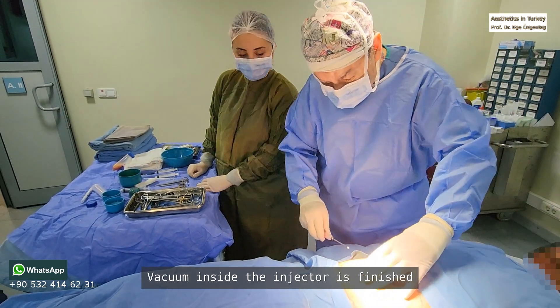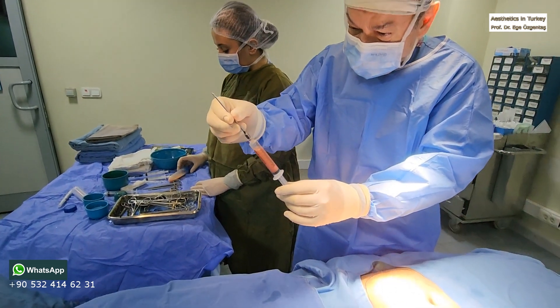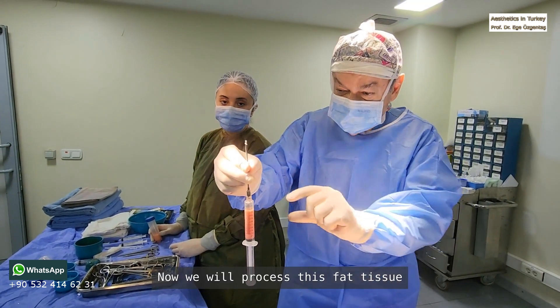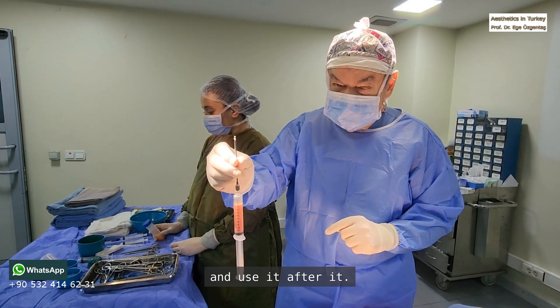The vacuum inside the injector is finished. You can see the amount of fat I harvested — at least seven to eight milliliters of fat. Now we will process this fat tissue and use it after.